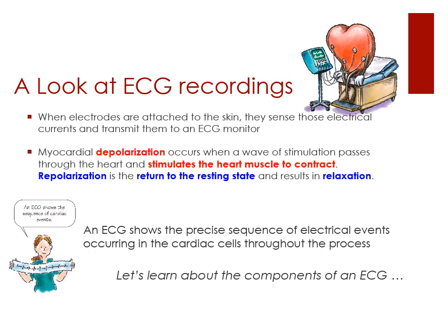So when you start looking at your EKG, when they talk about depolarization, all they mean is that an impulse gets stimulated and it causes the muscles to contract. So depolarization just means the heart contracts. Repolarization means that the heart has to relax. It's not in a continual state of pump. It has to relax, so that way it can pump again. And that repolarization, or returning to the resting state, is relaxation. So repolarization, relaxation; depolarization, contraction. So really all an EKG shows is those electrical impulses that cause those contractions of both the atria and the ventricles.